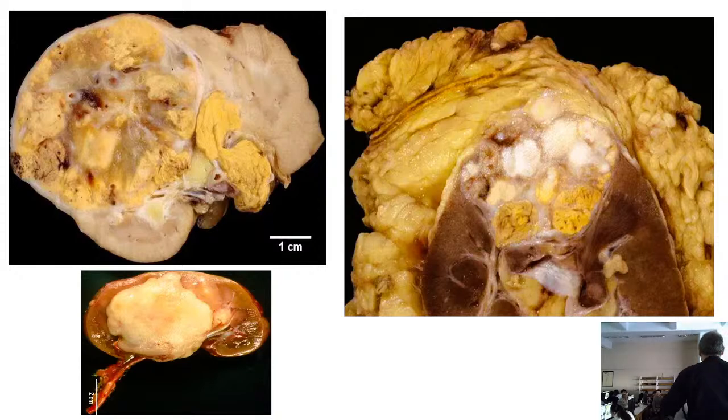They look like spindle cells or rhabdomyoblasts. They resemble sarcomas. That's why we call it sarcomatoid, looking like sarcomas, despite being of epithelial lineage. And this increases the biological aggressiveness of the renal cell carcinoma considerably and should always be checked. And of course, we may have some invasion here in the perirenal fat.